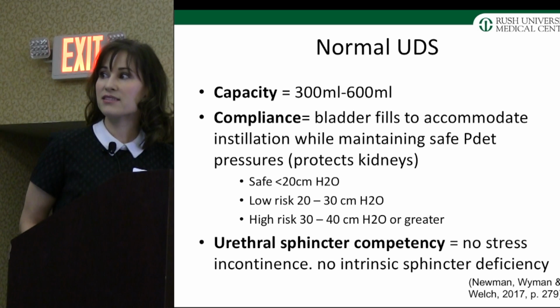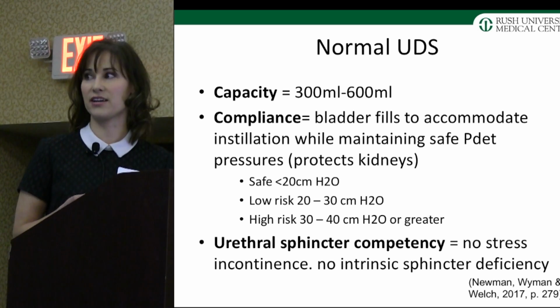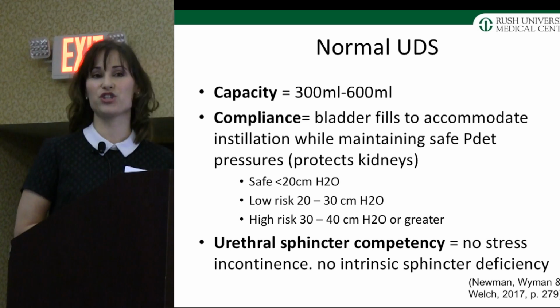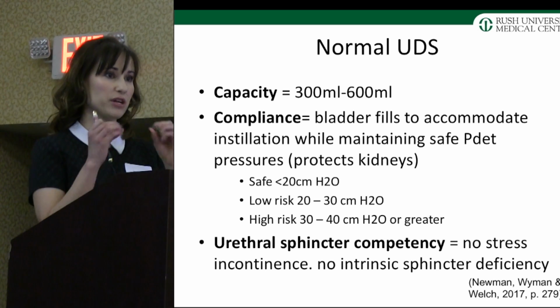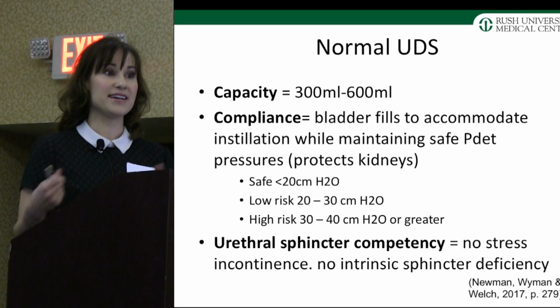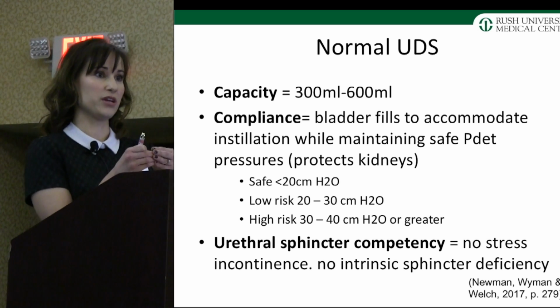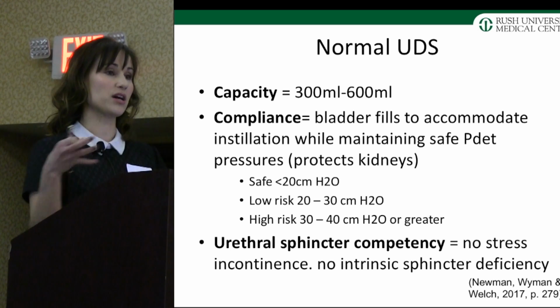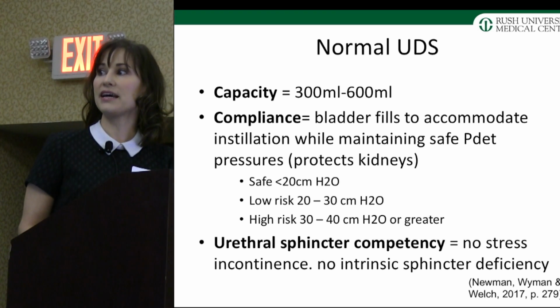The compliance, so the bladder is going to fill, and I listened to a presentation with Michael Gray, and he had a great analogy. He described a good compliant bladder as like a very thin balloon that you can blow up, and it opens up easily to accommodate the air. And then a non-compliant bladder or low compliance is if you had like a leather balloon and you're trying to blow that up. The pressure is just getting higher, but it's not expanding to accommodate that airspace. So that's what we mean when we're talking about compliance.